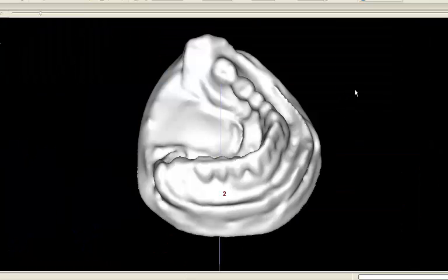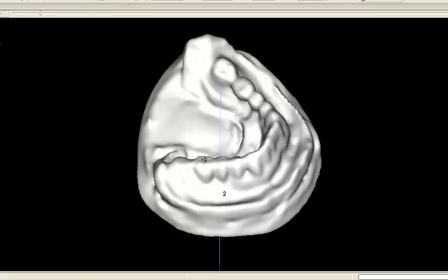In this example, future tooth position will be represented by a previous fixed bridge which will be removed so two implants can be placed.